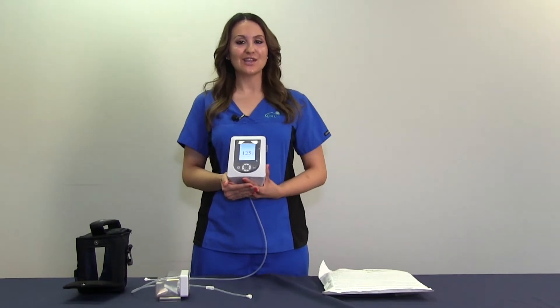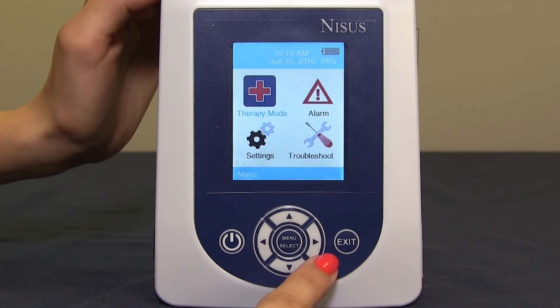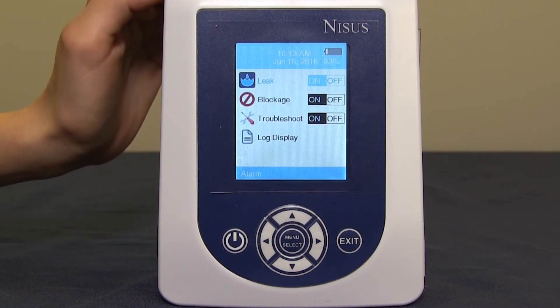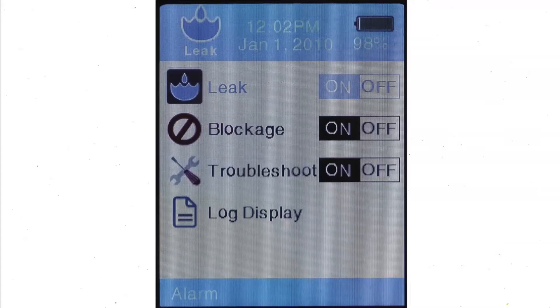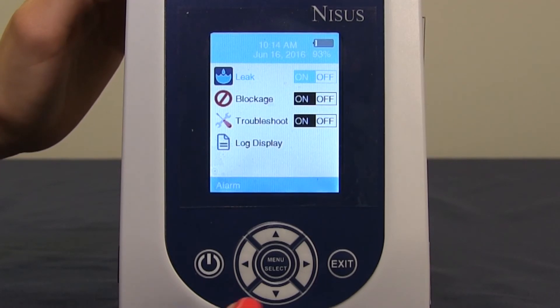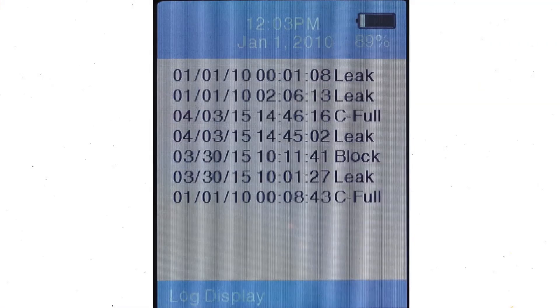In order to access the alarms, locate menu select, and arrow over to highlight the alarms. Once highlighted, press menu select. Here you will see leak, blockage, troubleshooting, and log display. Ensure that leak, blockage, and troubleshooting menu are on. Make sure that the highlight is over the on selection. Arrow down to highlight log display. This section will display the alarms that have occurred with date and time.